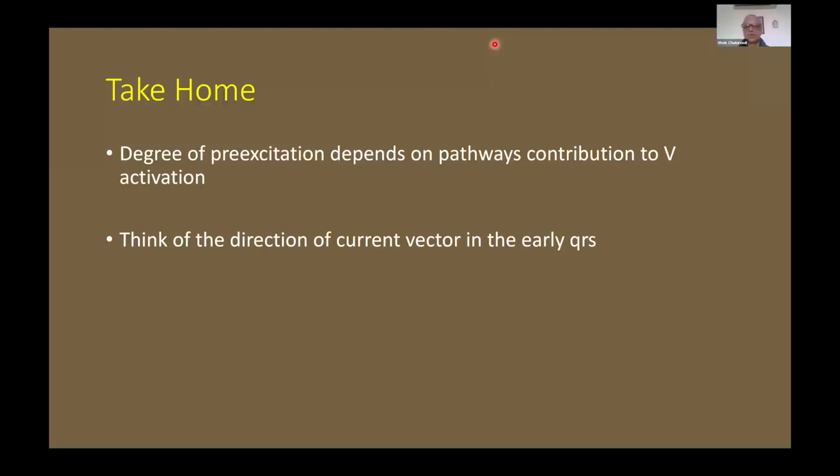So thank you so much, John. This was a wonderful lecture, and I really hated to interrupt you in between because I really think that more time should have been given to this particular topic because this is of utmost relevance to any cardiologist for that matter, and pediatricians also. So I think it's very clear that you need a maximally pre-excited ECG for really localizing the pathway in any meaningful way. And the left-sided pathways, obviously, because it's so far away from the central leads, mostly get hidden because of the distance.